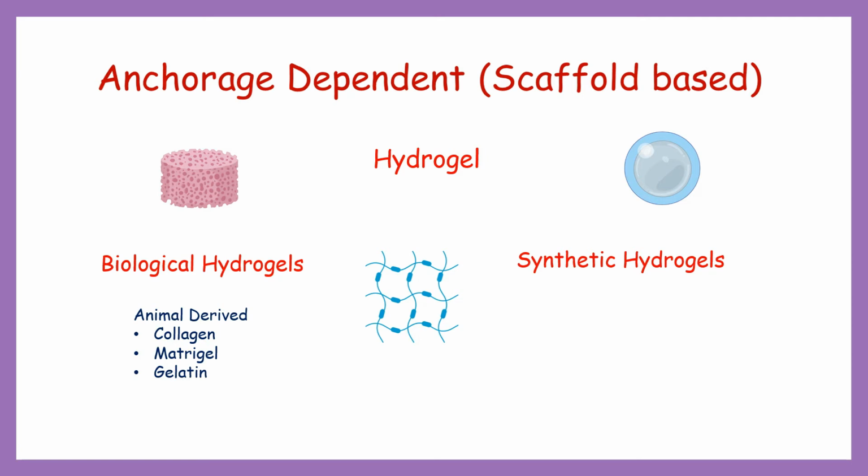Collagen, with type 1 collagen being the most abundant form, is the most widely used ECM protein for 3D cell culture. Gelatin is a partial thermally and chemically degraded product of collagen and can be stabilized by covalent modification. The possibility of covalent linking of functional groups also allows for the production of specialized gelatin gels.